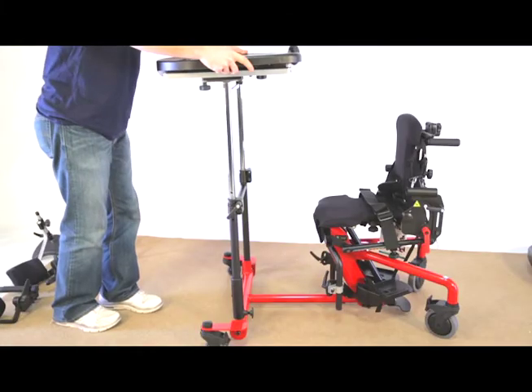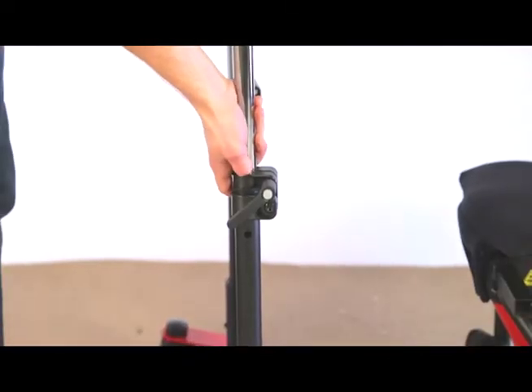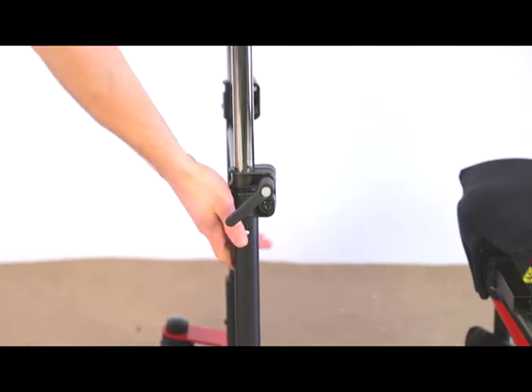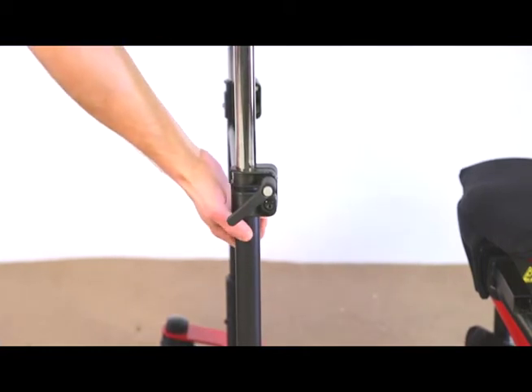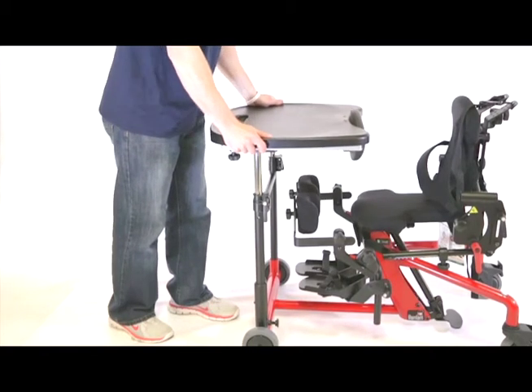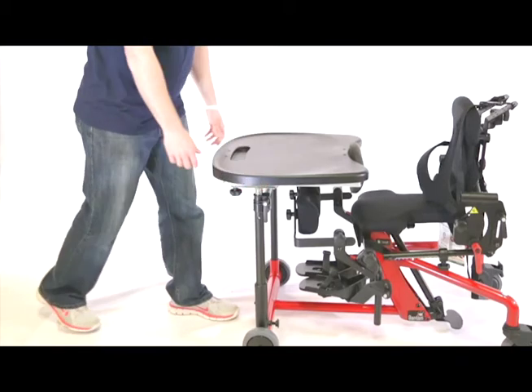Place the table bracket into the H-frame. Depress the spring button to allow the bracket to slide into the H-frame. Once you clear the clamp, the spring button needs to be depressed again and allow the tray to slide into position. Note, there is only one spring button. The spring button will stop in the maximum height position. Tighten knobs to secure the tray height.